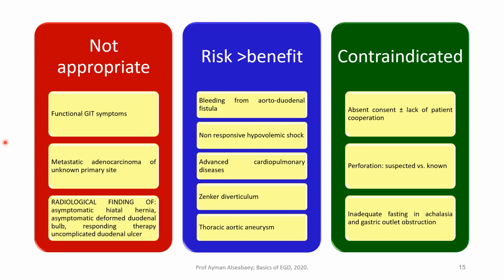You should not do endoscopy for a patient without informed written consent. This is very important. Sometimes the patient is not cooperative, especially if doing endoscopy without sedation or with local sedation, and if the patient is not cooperative, he may harm you and harm the endoscope itself. Okay. I remember a case, the patient was very, very strong, and he tried to pull out the endoscope from his mouth while catching the endoscope shaft. Because he is very strong, he pressed markedly on the shaft, so the shaft turned to paper. Okay, a very, very thin part. Of course, the endoscope was of no more use.